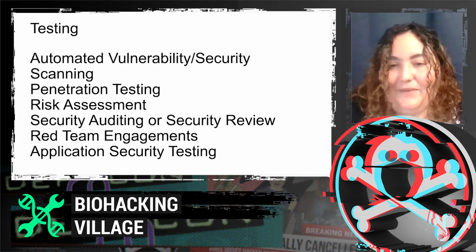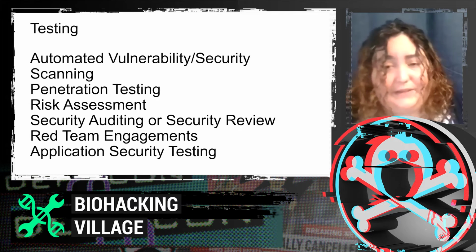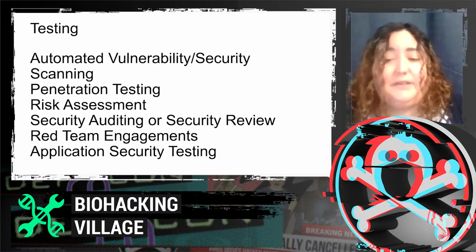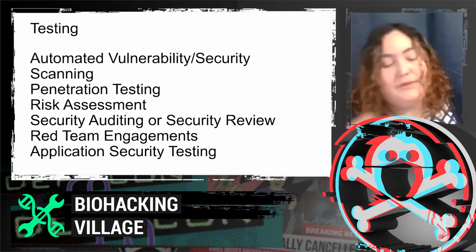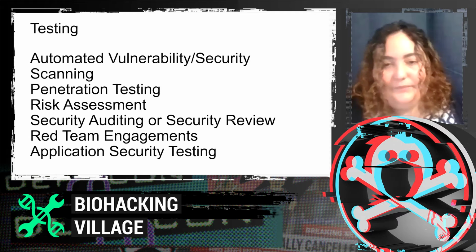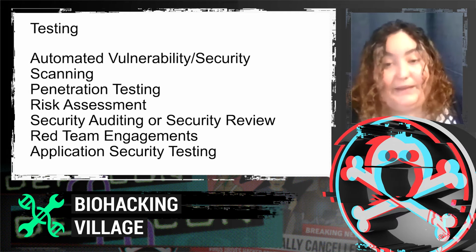The final note here is application security testing. At some hospitals, there will be some level of development. This is the process of testing, analyzing, and reporting on the security level or posture of a particular application. It's used a lot in web development, but also app development, like for Apple applications. It's a way to test and gauge the security strength of that application, and then find areas that you can remediate.